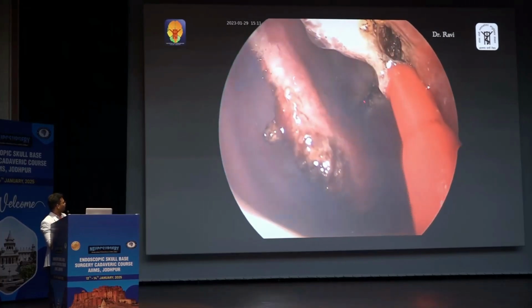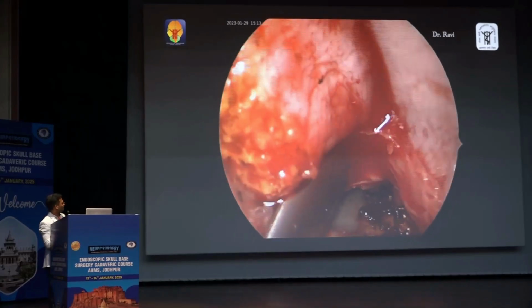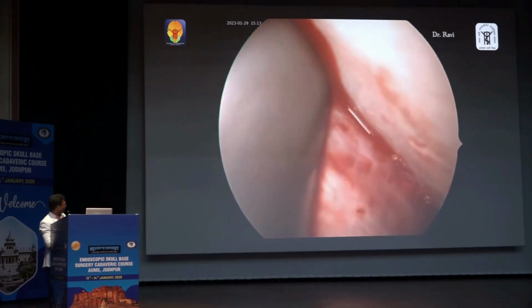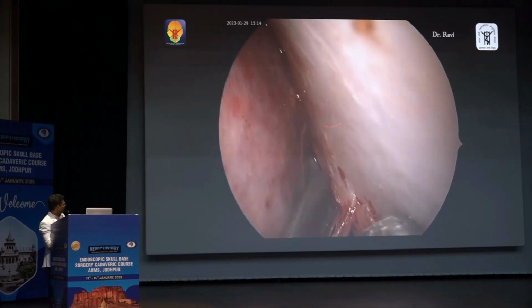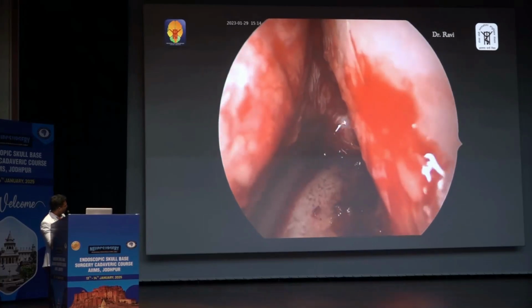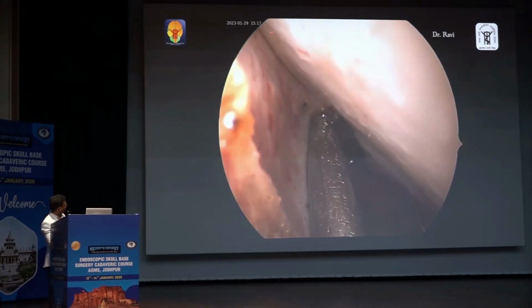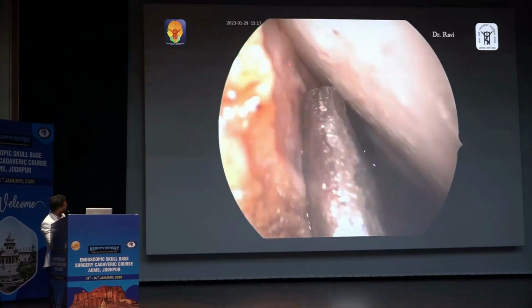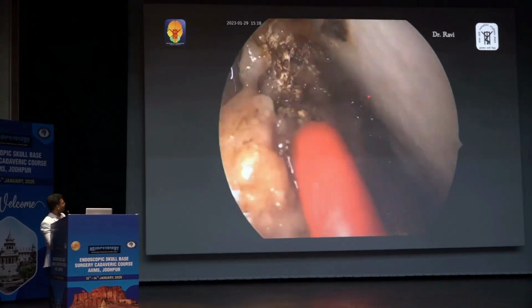Okay, so then the superior incision. Another difficult area is the more superior incision. How do we do that? I never make a superior incision from the nasal cavity. I elevate the flap, go inside the flap, and free the flap till the posterior edge, right? So from inside the flap, I get the dorsum of the septum, dorsum of the nose. From the inside, it is safer.